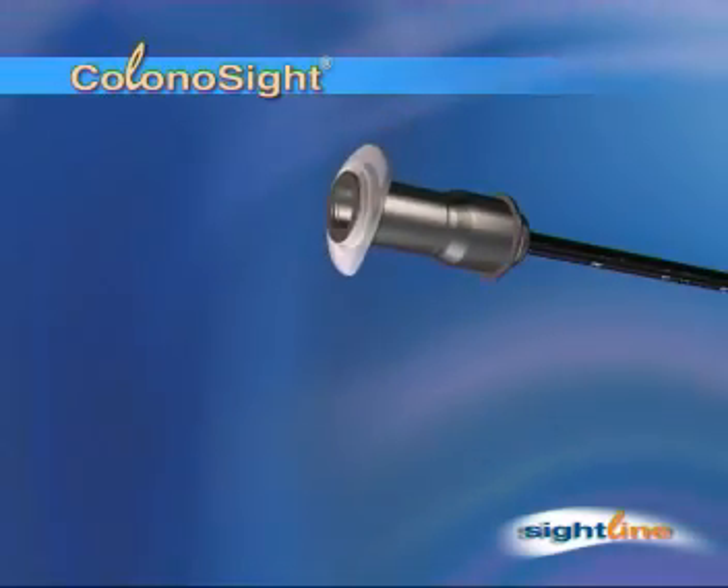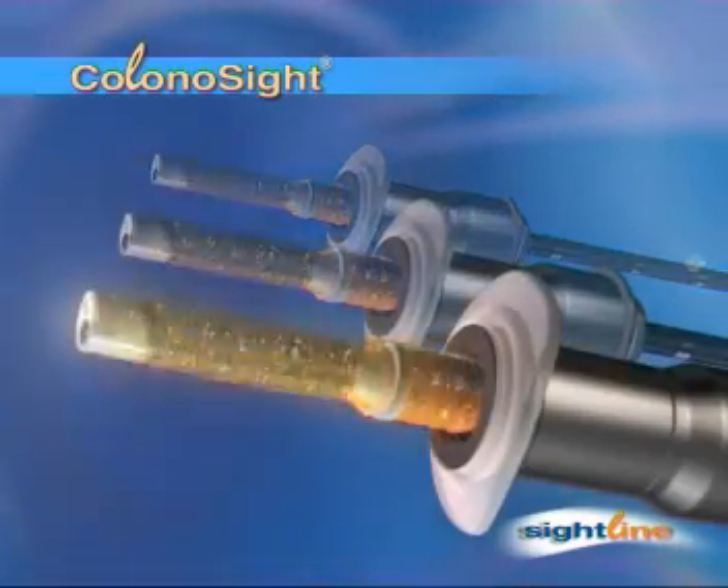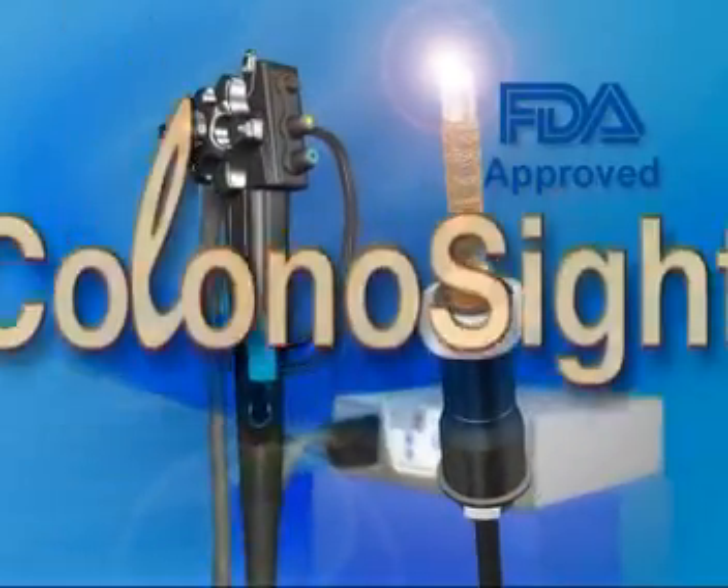Each patient is examined using a fresh disposable kit. FDA-approved Colonosight, revolutionizing the field of colonoscopy.